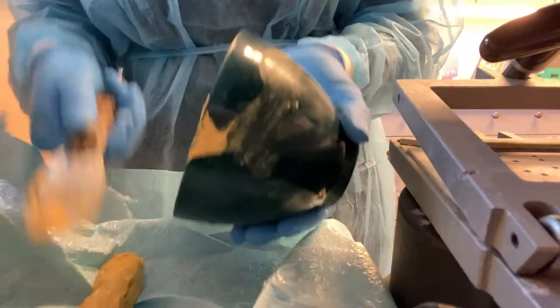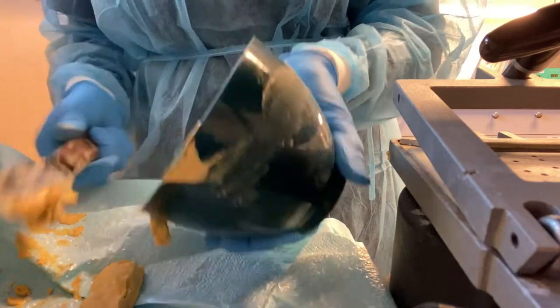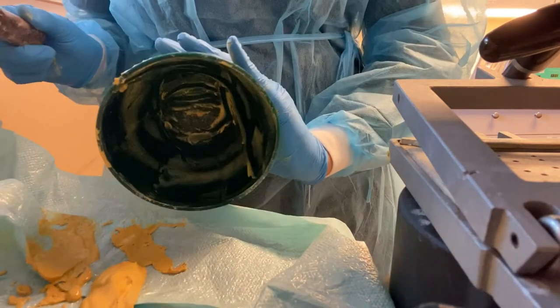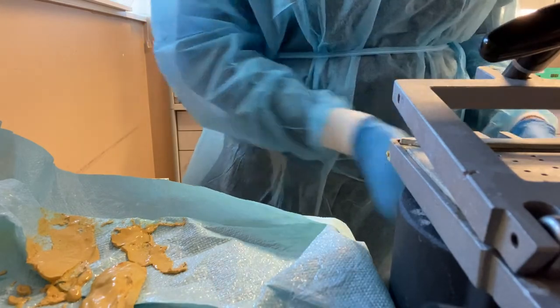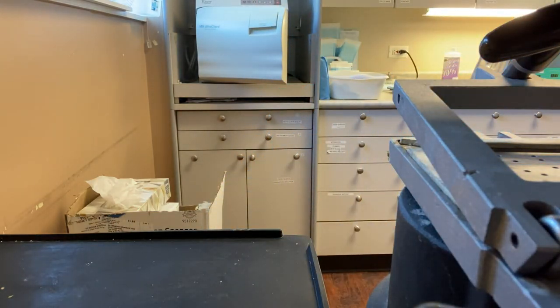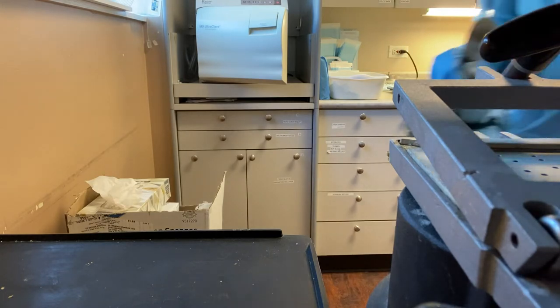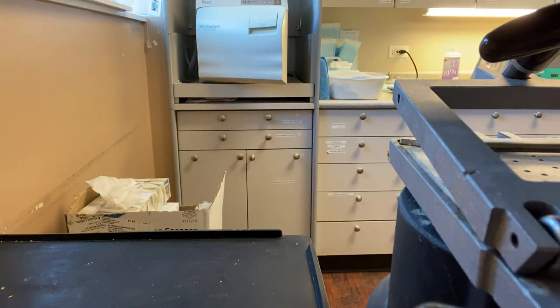Just a quick tip, anytime you are cleaning up stone, please do not put it down the sink, because stone, as everyone knows, turns hard. If you rinse it down the sink, it hardens in the drains and messes the drains up. So it's always best to dump it in the garbage. And when you're cleaning your bowls, please make sure that you clean them thoroughly. When we go to grab new bowls, we shouldn't see any extra residue. These are the impressions that I took from earlier. This is alginate. I'm going to clean those out, and then I'll show you how the clean bowl should look at the end.